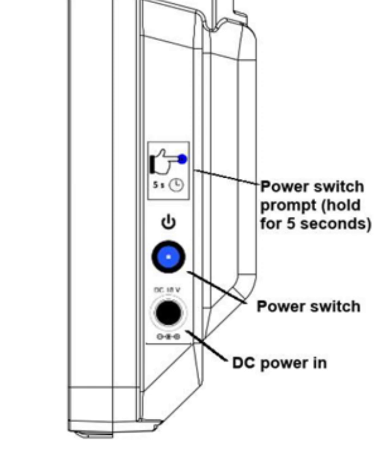To turn on the Argos monitor, you will press and hold the blue button found on the right side of the monitor for 5 seconds. This is 5 whole seconds by the clock.